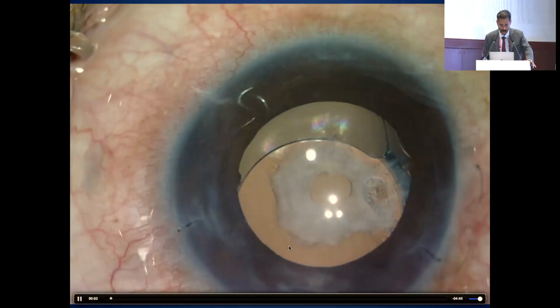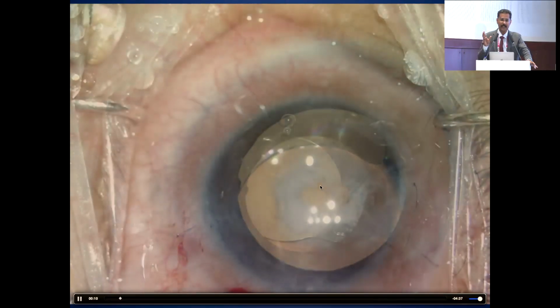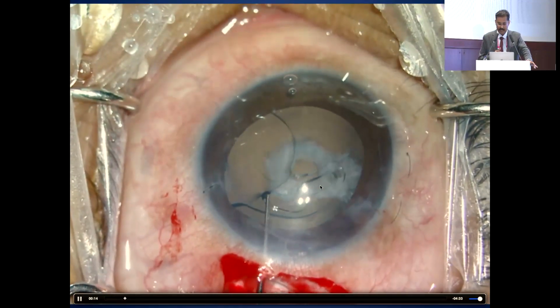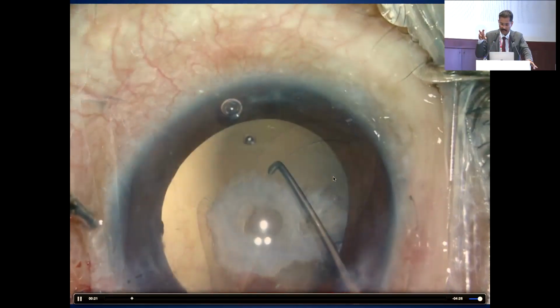Because we have 5 minutes more, just to show you some, this is one pediatric cataract. The lens was placed in the sulcus and left there. This kind of single piece lens gets decentered badly, and that can be exchanged, but then see what happened to the rhexis margin. See the kind of fibrosis which happens and the adhesion of the anterior and the posterior capsule.